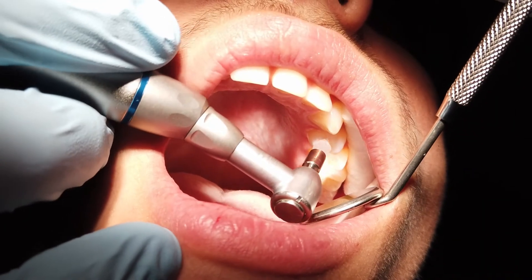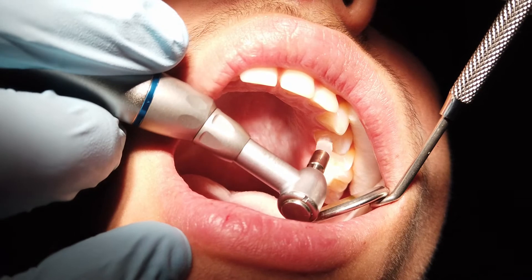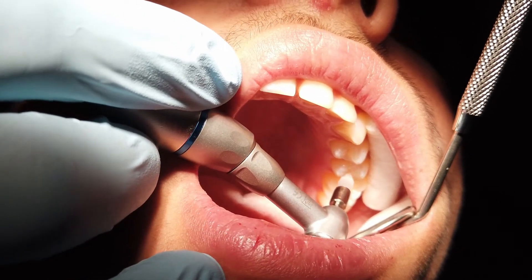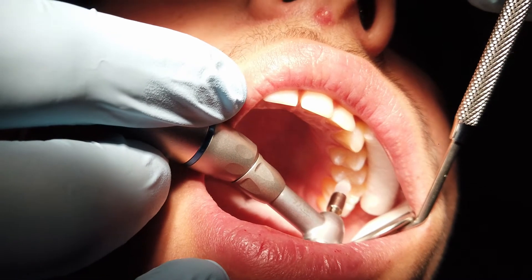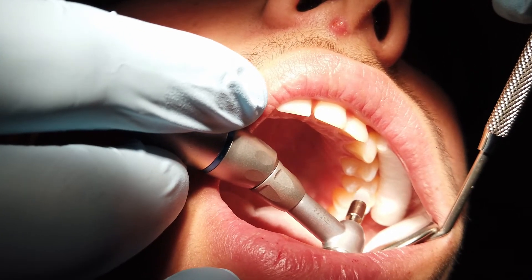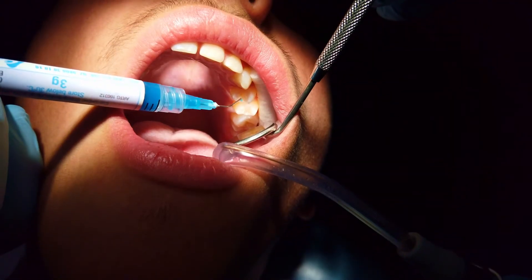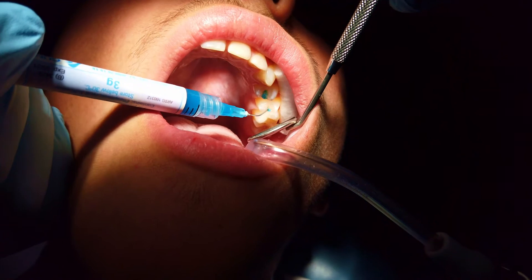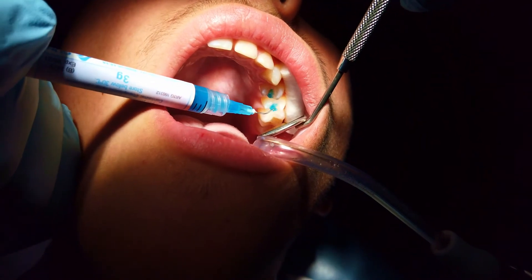This is conducted by first cleaning the surface of the grooves of the teeth in order to remove any debris and plaque. A solution is then placed on the grooves to further clean the surface, and that creates a better bond for the sealant to stick for a long period of time.